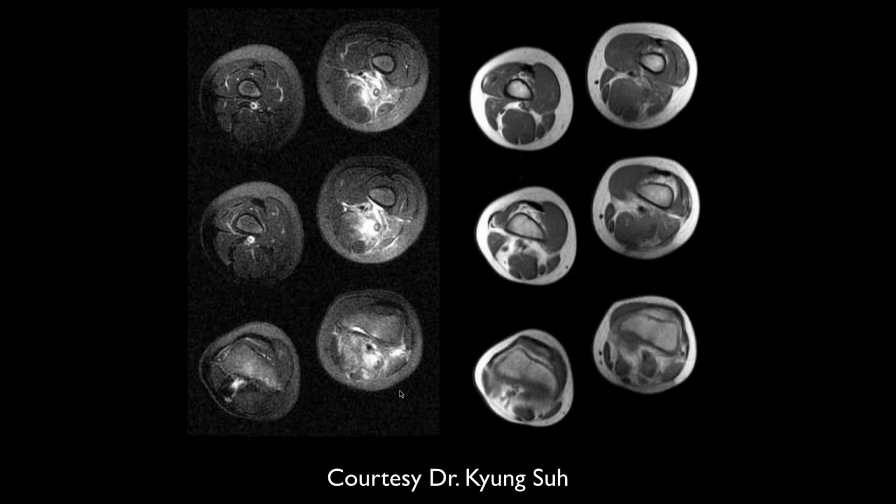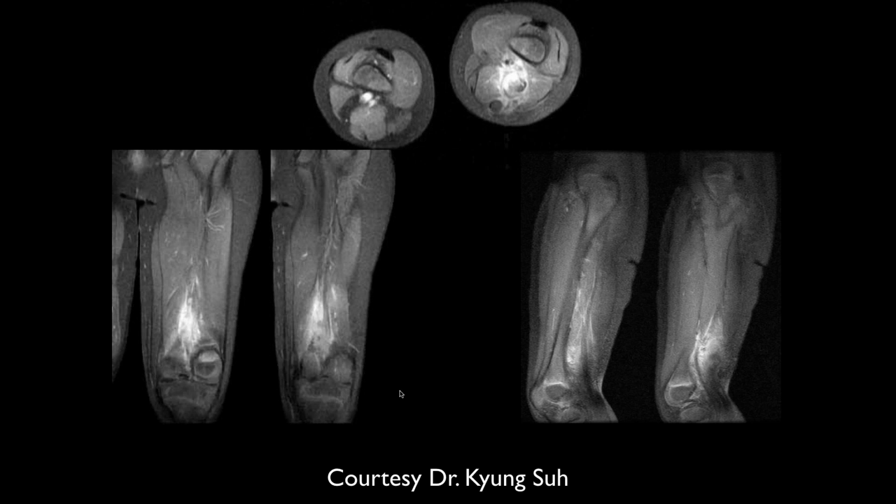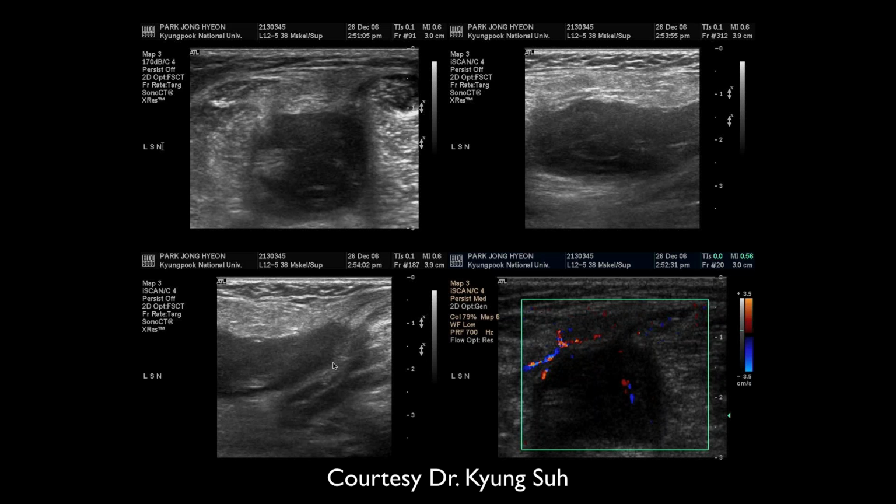Yes, I think we're dealing with skeletal muscle tumors. But what we can see is the margins are very indistinct. This one did enhance quite vigorously. There's the ultrasound showing some vascularity around it anyway.